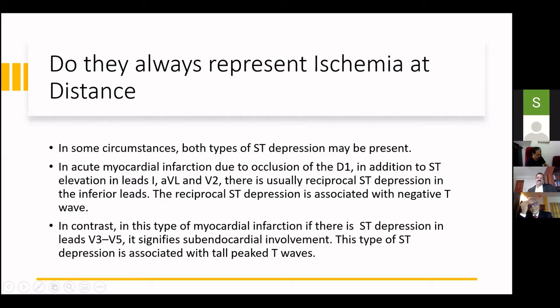whenever you have a patient with an ischemic heart disease coming with an ST elevation myocardial infarction, they can have ST depressions and T wave inversions in the leads that are outside the purview of your diagnosis. For example, in an inferior wall infarct, having ST-T changes outside 2, 3, AVF, we'll have to know whether the patient has an additional artery disease or it is only a one vessel involvement, because that has a diagnostic, prognostic, and therapeutic value.